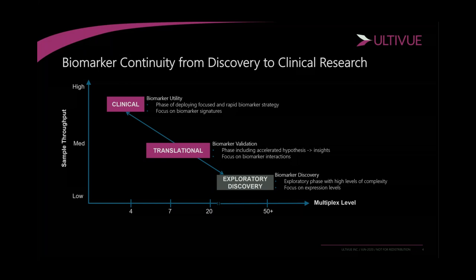So if we're looking at exploratory discovery, this is a more biomarker discovery phase where there's a high level of complexity because you're looking at so many biomarkers and there's a focus on expression levels and heat map comparisons. Over here, you're trying to find out what is standing out based off of your experiment. So naturally, you need a lot of markers, sometimes 40, sometimes 50, and the sample throughput is low because you're already getting so much out of those samples.